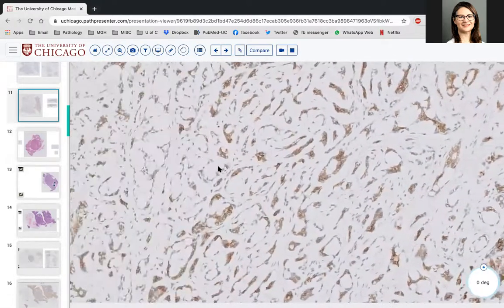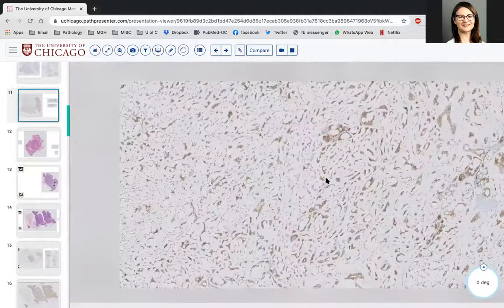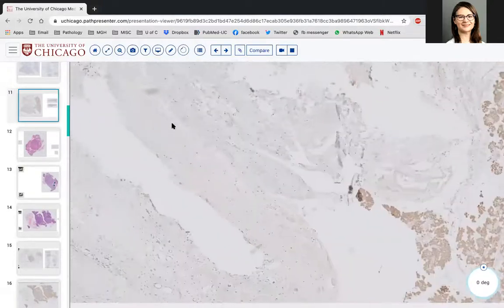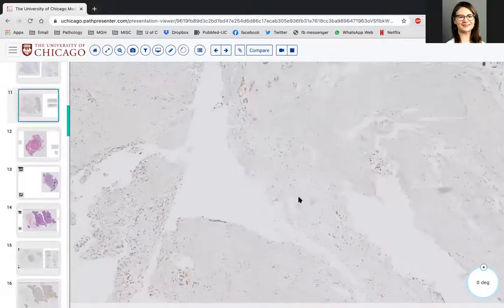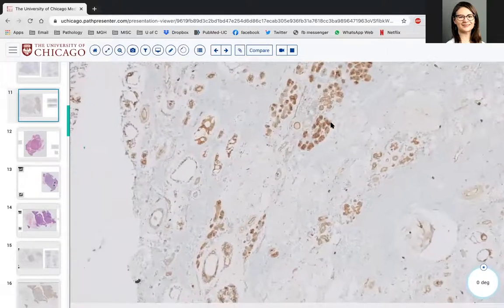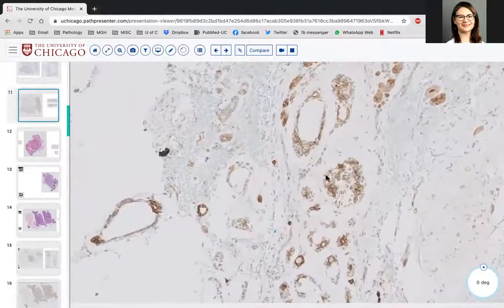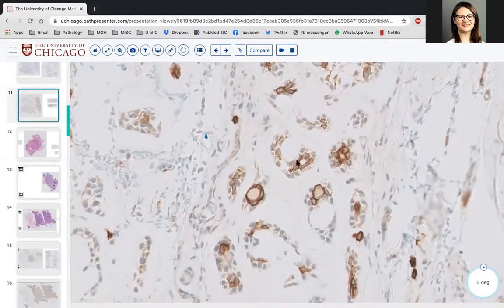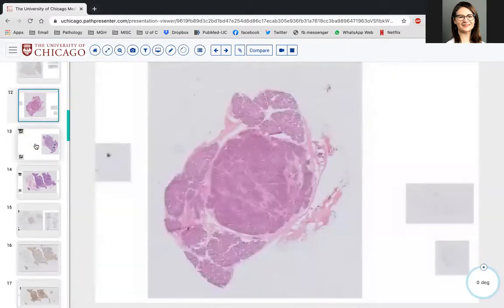Remember that the P40, P63, C-kit pattern would essentially be identical in the ductal or tubular areas of a pleomorphic adenoma. So it shouldn't be 100% diagnostic, but it could certainly push you to at least a biphasic neoplasm in context of other stuff. All right, questions or comments? Yeah, so PA and adenoid cystic can be very challenging to differentiate from one another, but I think you guys did a very nice job.